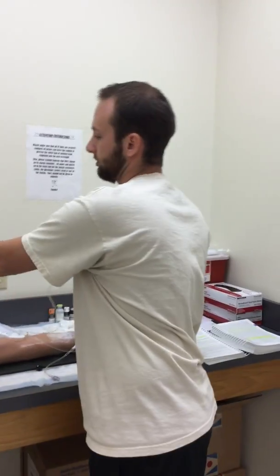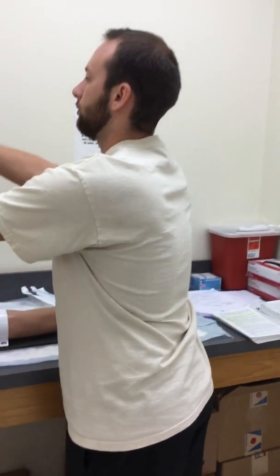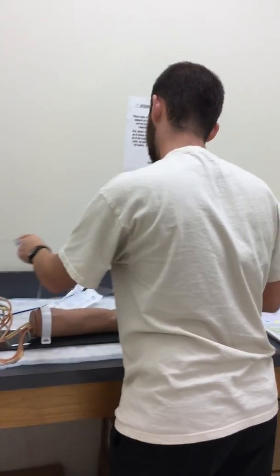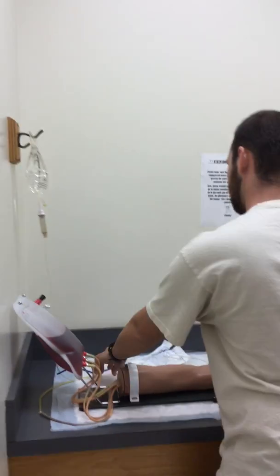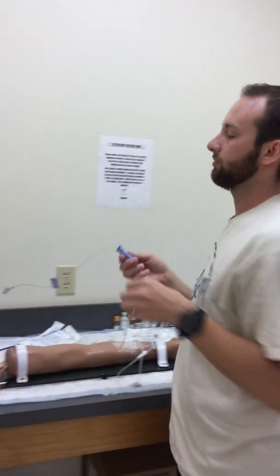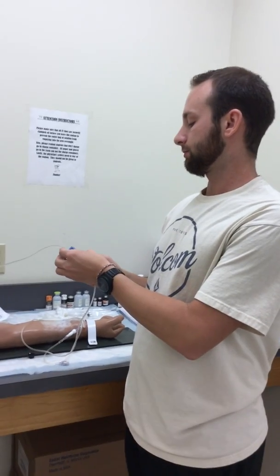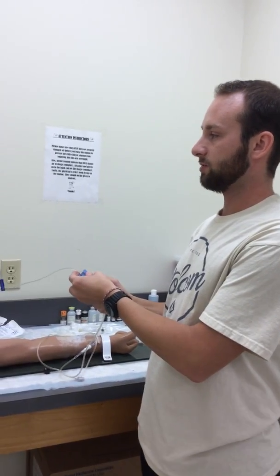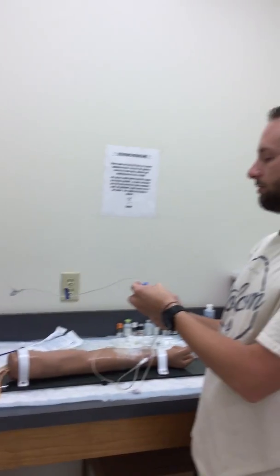And then we would want to hang this back up high where it was before we started. And then we would want to reset the rate for the primary infusion at what the doctor had. And set this back at what the doctor had ordered, as drops per minute or milliliters an hour, whatever the doctor had ordered before this.